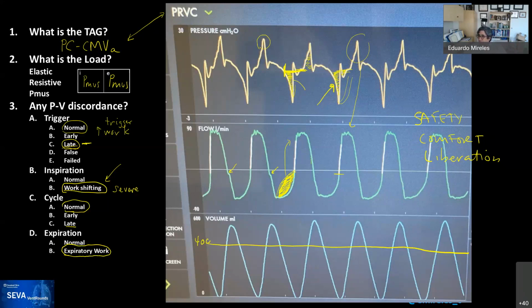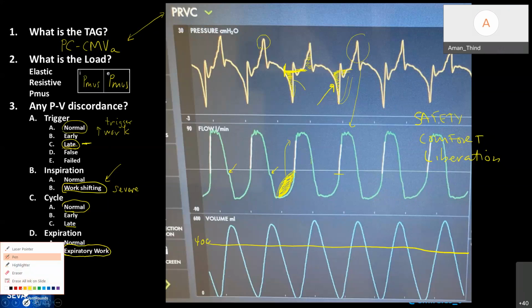Aman, can you speak? Yeah, go ahead. Awesome. Yeah. So again, it depends on the goal. If you're okay with the tidal volume and we are moving towards comfort, then that's one option, to do pressure support if you don't have a servo targeting mode, for example, in Servo-i.